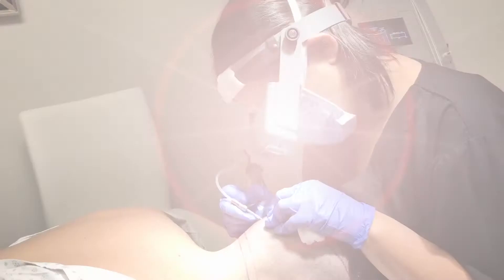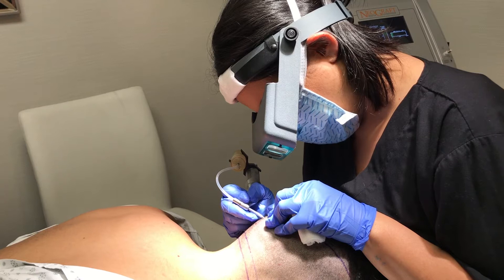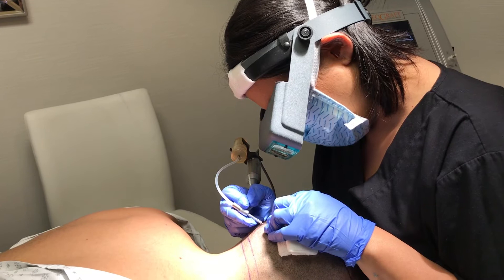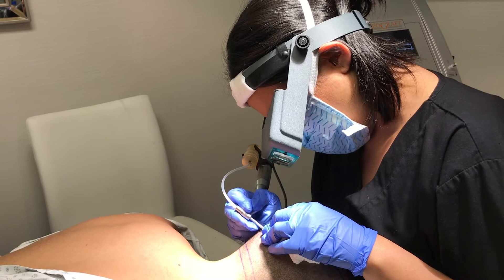We're starting the procedure now. Each individual follicular unit is being extracted — this is why it's called follicular unit extraction, or FUE. This type of transplant takes out each individual follicle or follicular unit. There are no scalpels and no sutures, and it makes every single hair removal completely imperceptible after you heal. The patient, especially male patients, can still wear their hair short.